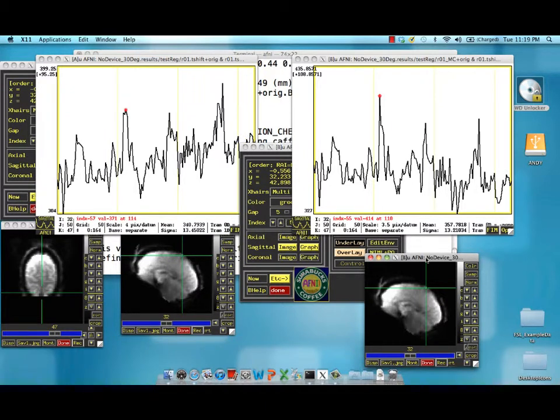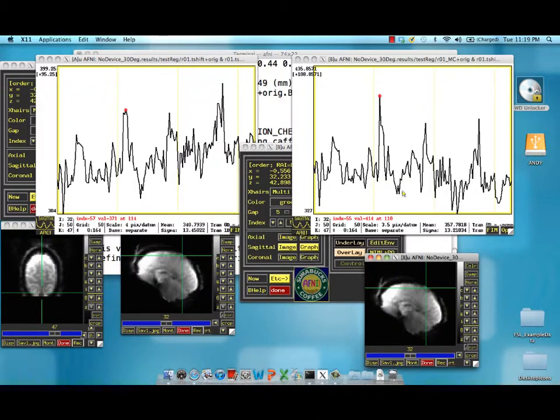Since we've motion corrected, and we've overlaid every volume in the time series on top of a base or reference image, when we go through this entire time series, there shouldn't be any motion that you can see in this pane.